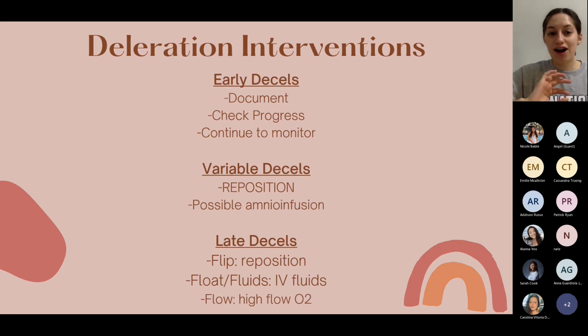All right. So these are our deceleration interventions. So for early decelerations, just document, continue to check progress, and continue to monitor. But again, these are good things. We want to see them.